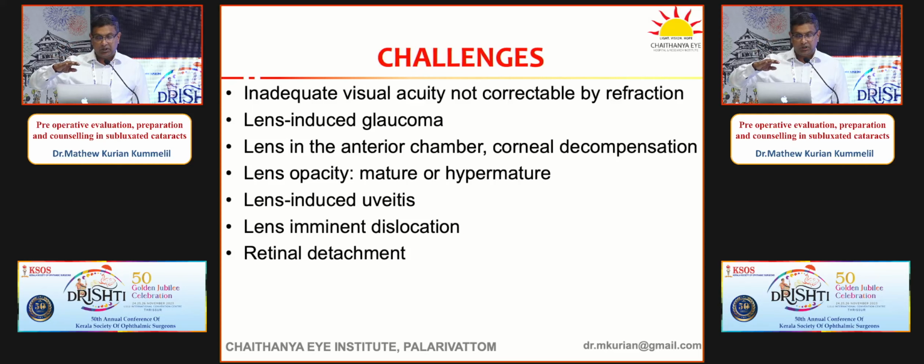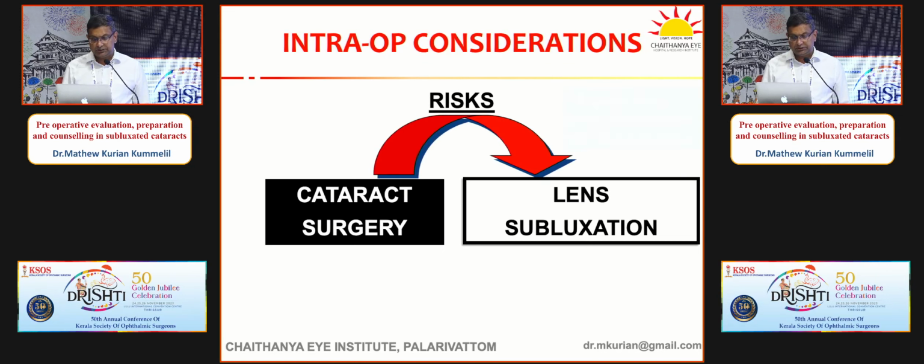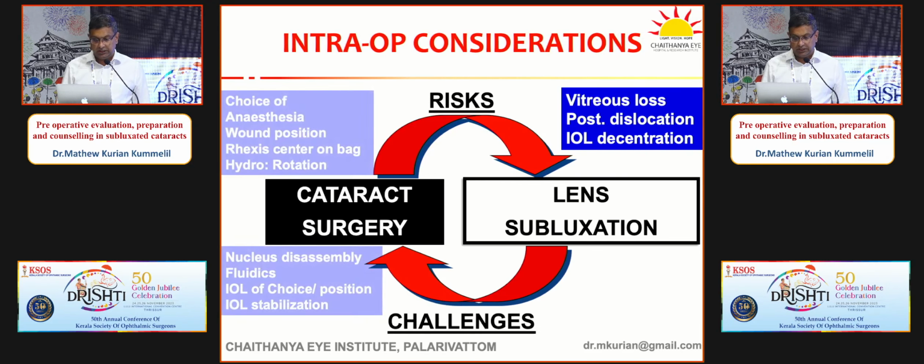Once we finish the block, after giving the digital massage, we found that the lens was on the macula, so it became a retina case. And in all these cases, retinal detachment is very possible. Intraoperative considerations: cataract surgery increases the risk of subluxation, vitreous loss, posterior dislocation, even IOL decentration at a later stage.